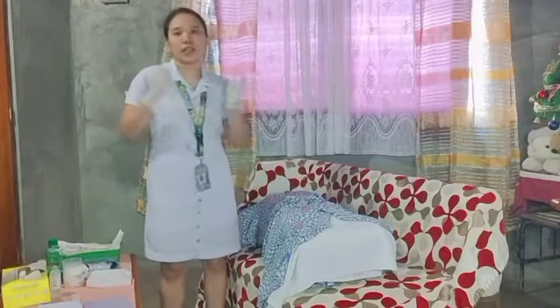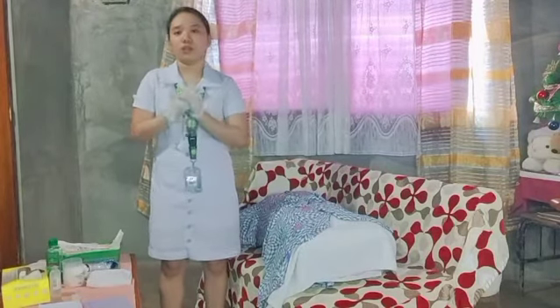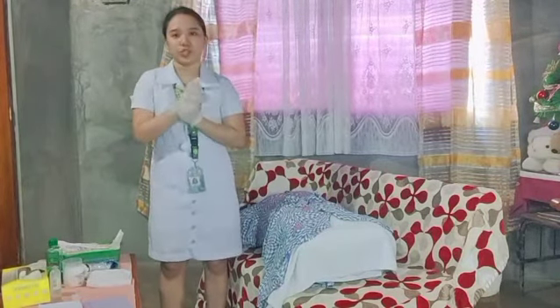So, also provide for the client's privacy, the rationale so that the patient will be comfortable during the whole procedure.